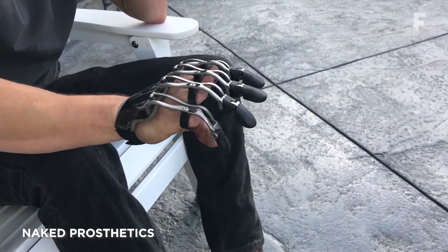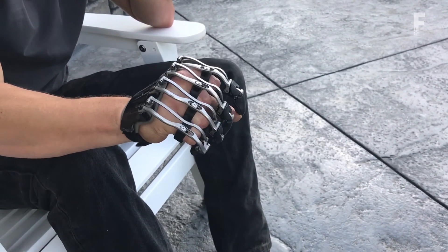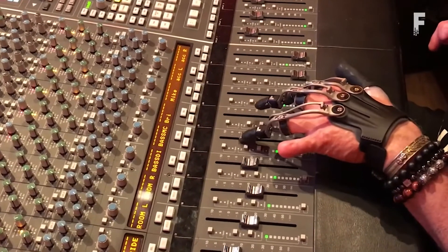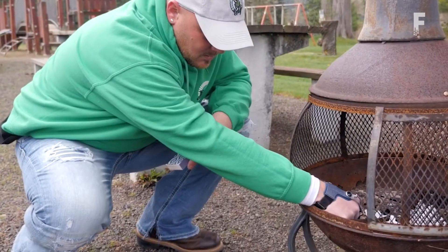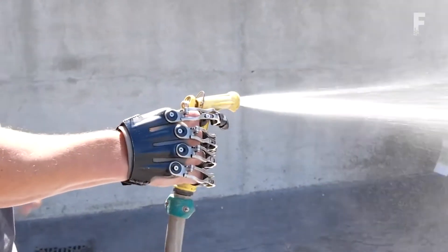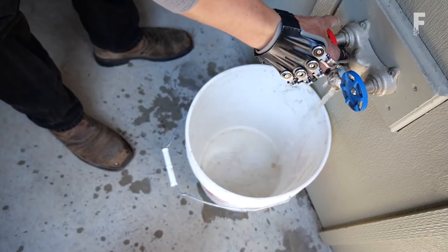Naked Prosthetics manufacture durable, custom fabricated finger prostheses to replace partial loss of the finger. The PIP driver, MCP driver, and thumb driver are all designed to restore functionality by mimicking the natural motions of the finger, all driven by the residual digit.